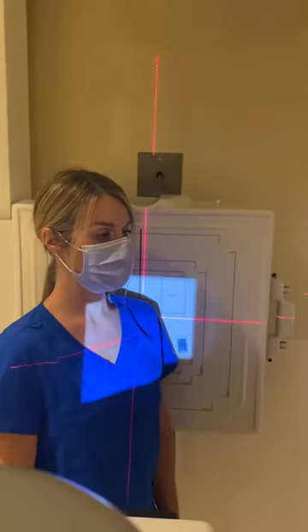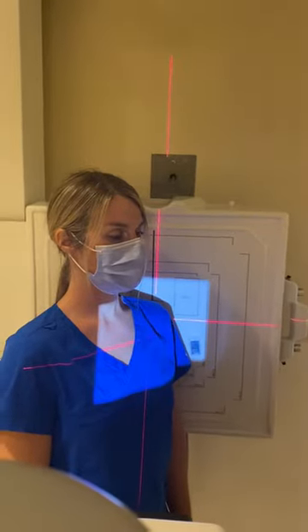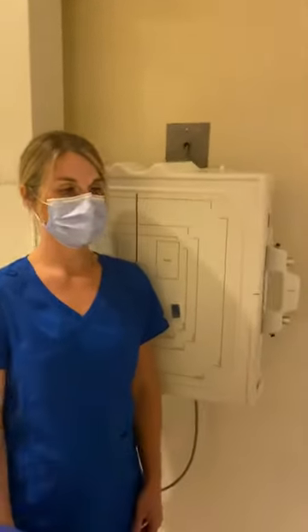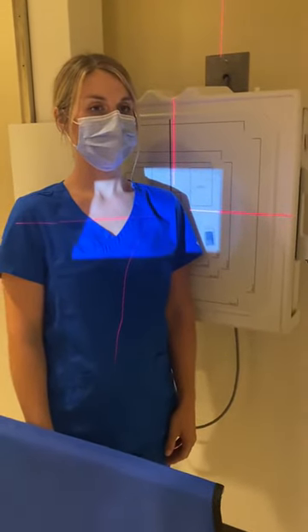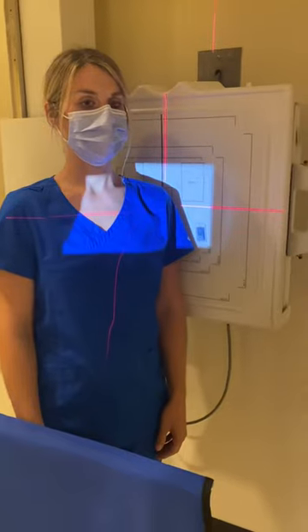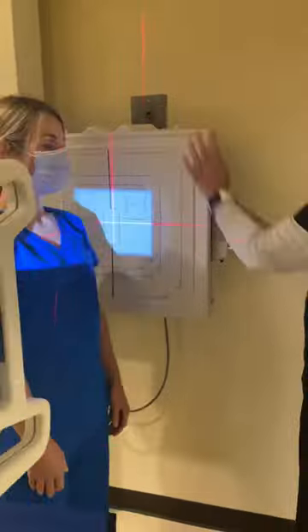We place the correct marker in the lower corner. We put our lead shielding up. This method is known as the Grashey. And now we will do the PA oblique scapular Y.